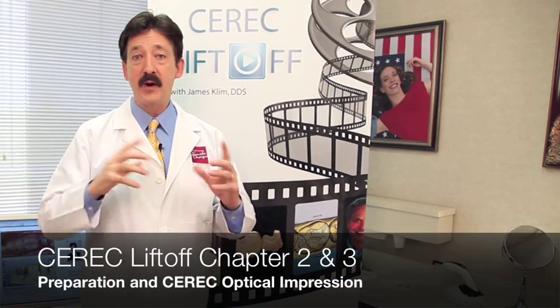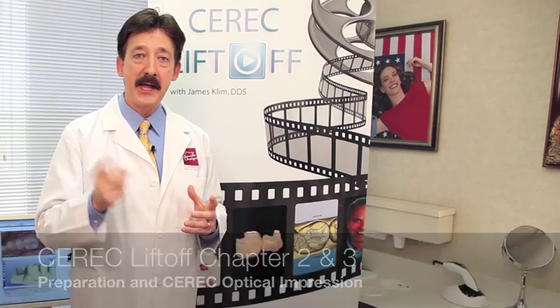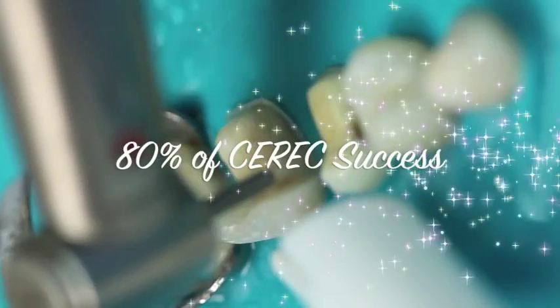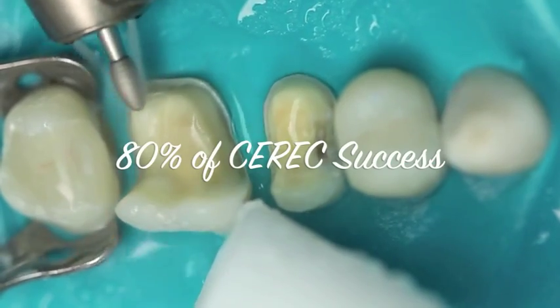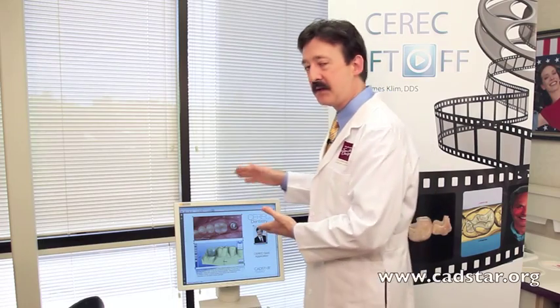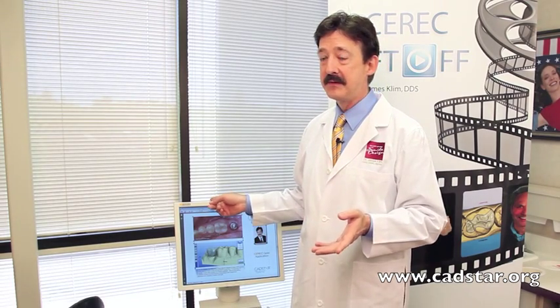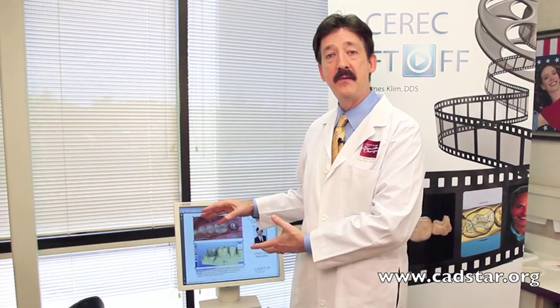Chapter two starts off with prep style. Eighty percent of our success happens in chapter two and chapter three — how you prepare and how you scan. The information that goes into this machine will dictate how your restoration is going to look. You can't work it out in the software outside of your parameters, so the software should be the easy part for us.